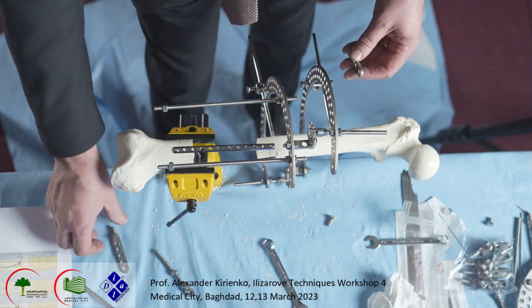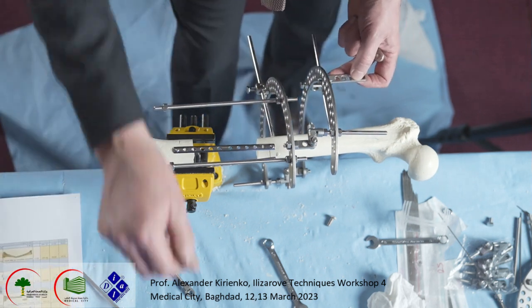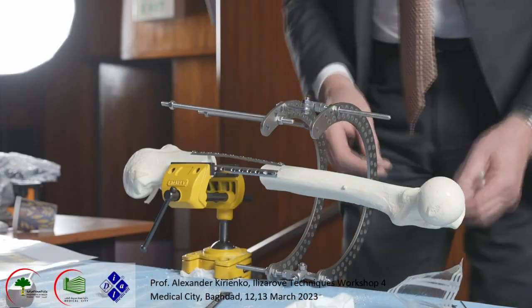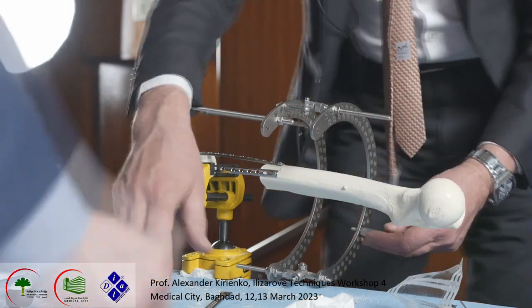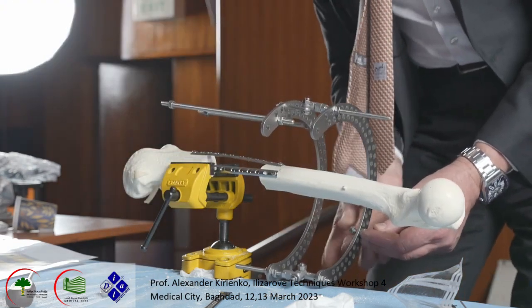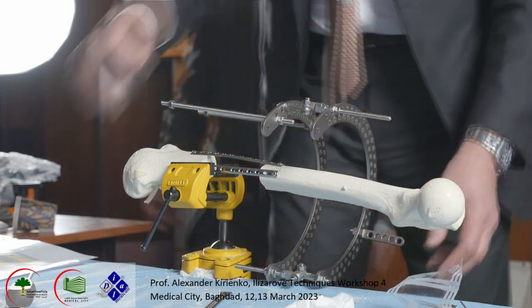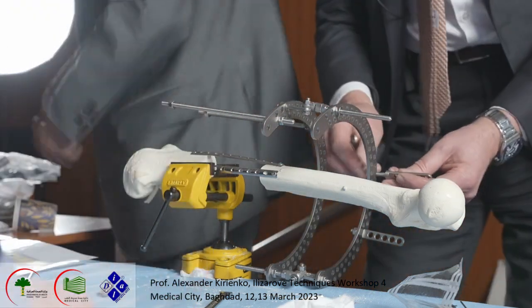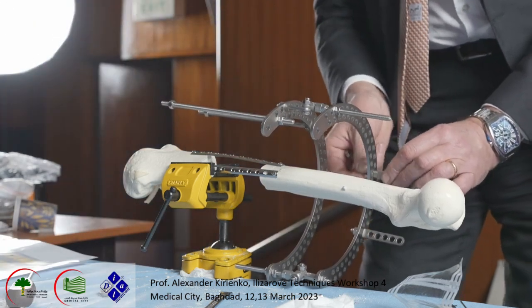For example, I may do like this here. I take a post. Okay, another one. There.